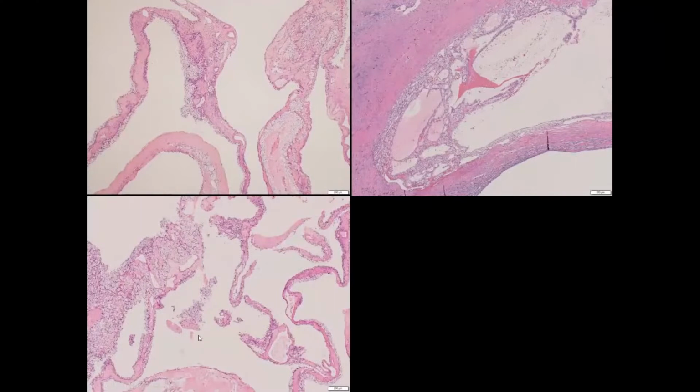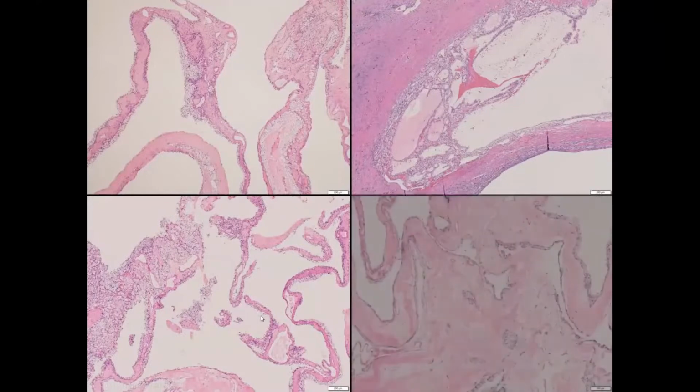And again, you see another example here where you have some septal growth of these clear cells, right? But the septal growth is not focal and it's not non-expansile. So you see this expansile growth occupying almost the entire thickness of the septation. So this will be your usual conventional clear cell renal carcinoma.